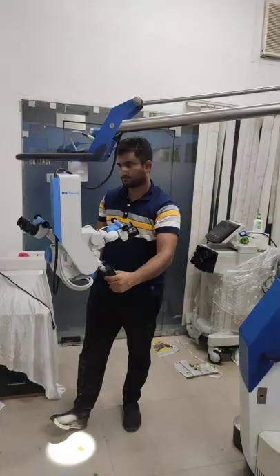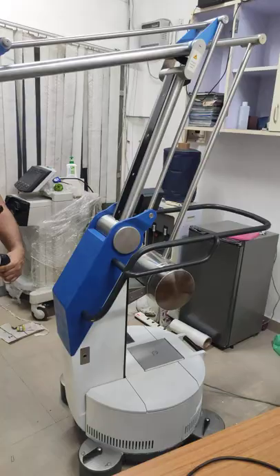I am very impressed with the condition of this microscope. It is a refurbished one, but it doesn't look like it — it looks very new to me.